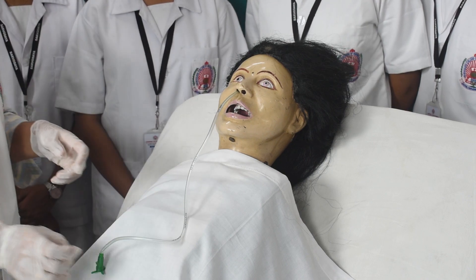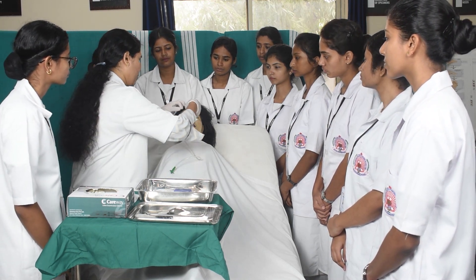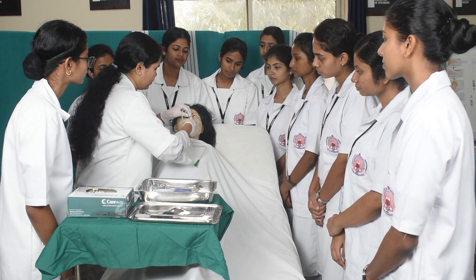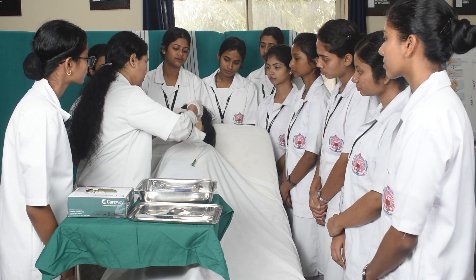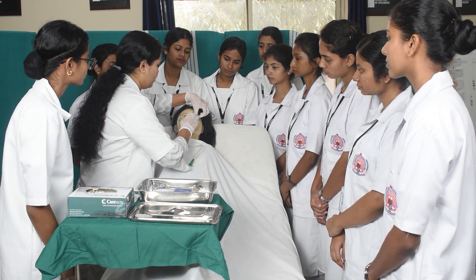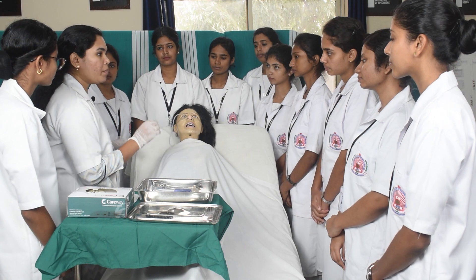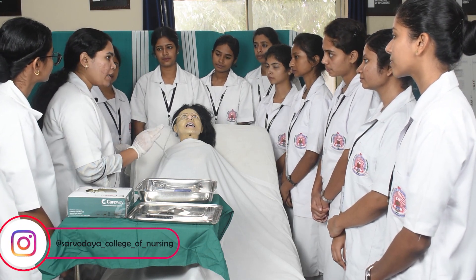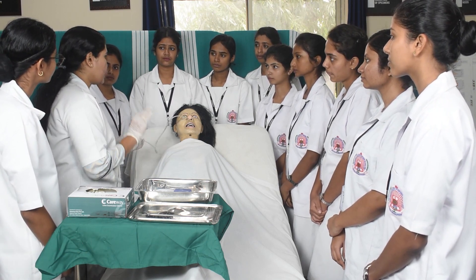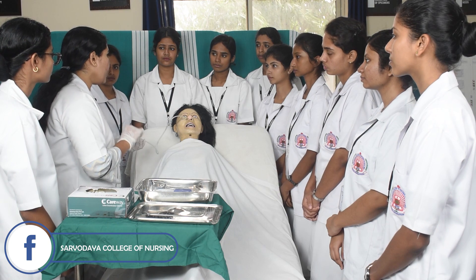After that, fix the ryle's tube with an adhesive tape or fixator. However, this is not the confirmatory test — before starting any feed through this tube, you must take a chest X-ray of the patient. It is mandatory; without a chest X-ray, you are not supposed to start any feed with this tube.